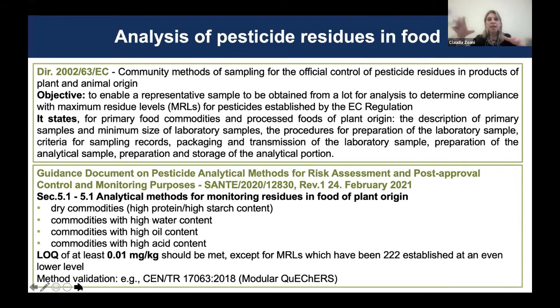For what concerns quantitative analysis, we have to take into consideration the guidance document on pesticide analytical methods for risk assessment and post-approval control and monitoring purposes, published by DG Sante in 2020 and revised last February.